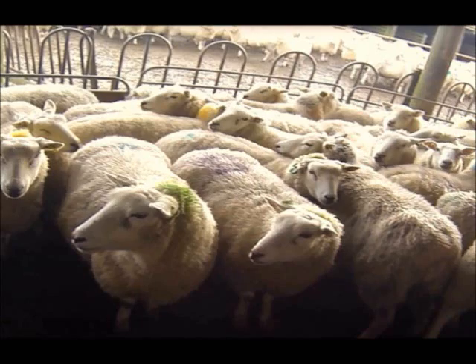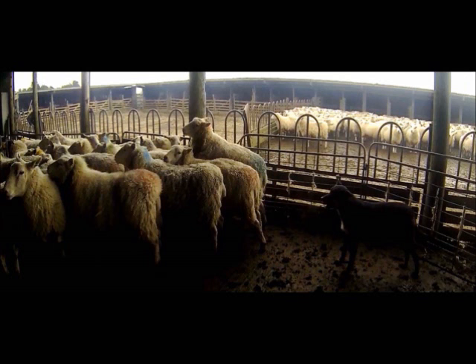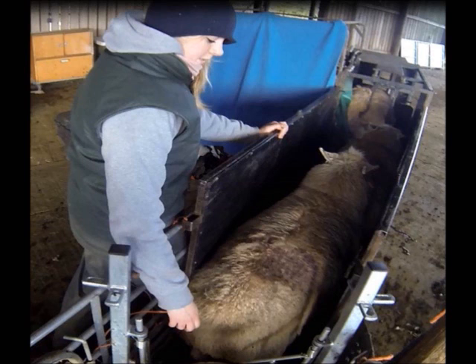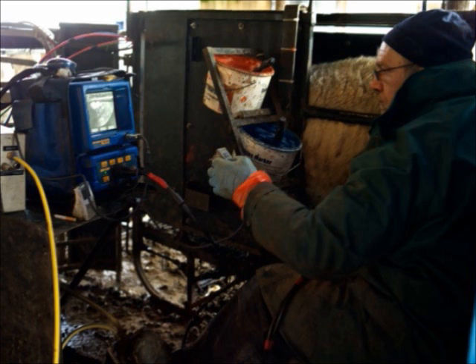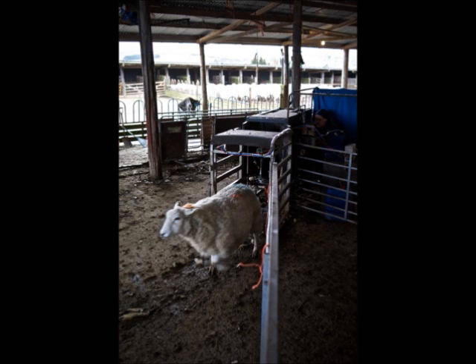All scanning done and the results are in. A ewe with twins scans at 200%. Ideally, as sheep only have two teats, two lambs are plenty. The scan result gives an average scanning percentage, so the nearer to 200% the better, as this means that on average there are more ewes carrying twins — just what we want. Our results? 179%. We are very pleased with this. This is a very good result.